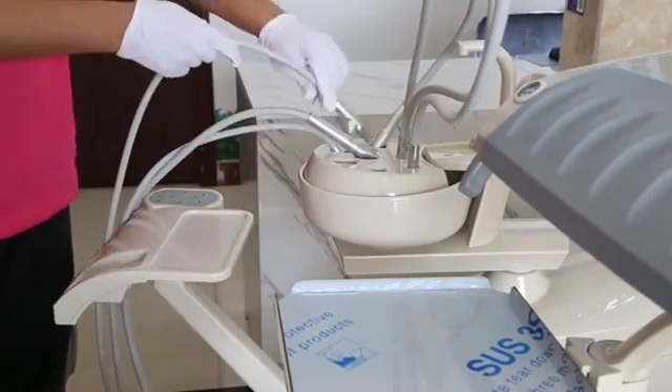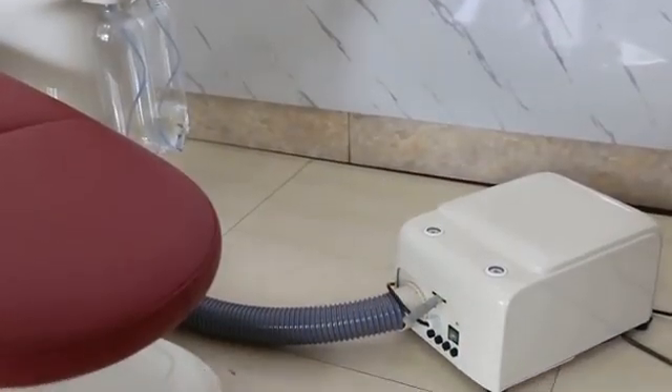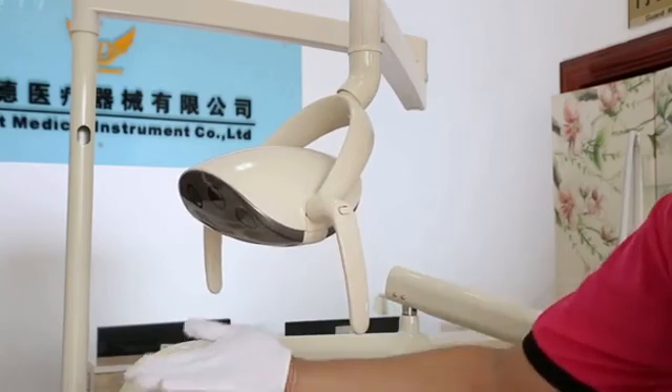Additional features include a fashionable LED sensor light, push-button multi-articulated headrest, and removable armrest. The detachable and rotatable luxury cuspidor is convenient for patients to spit, and it is also easy to clean.